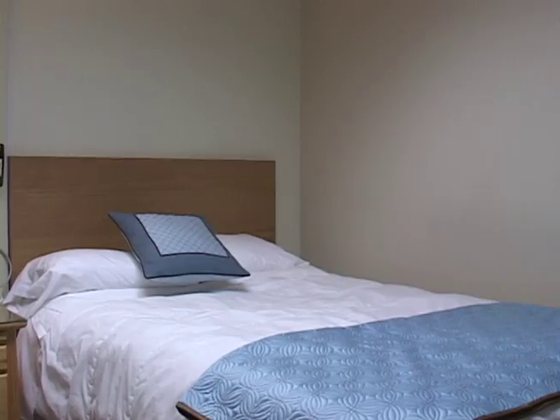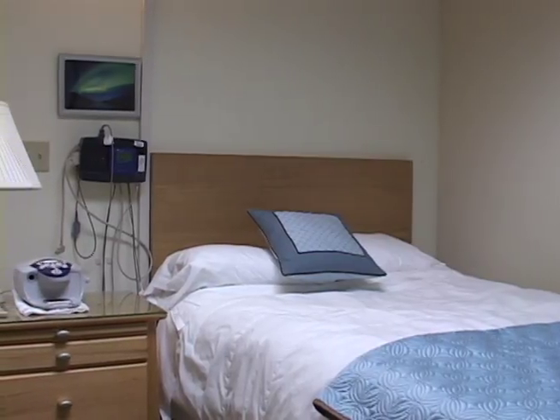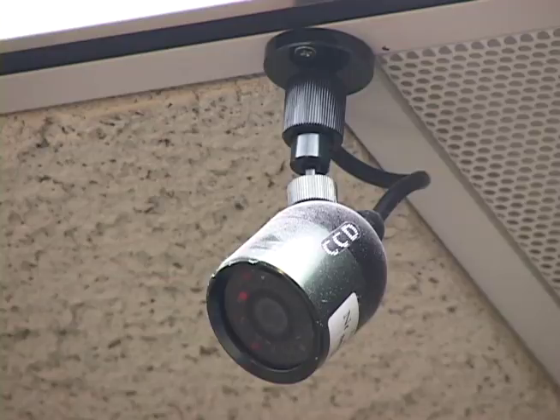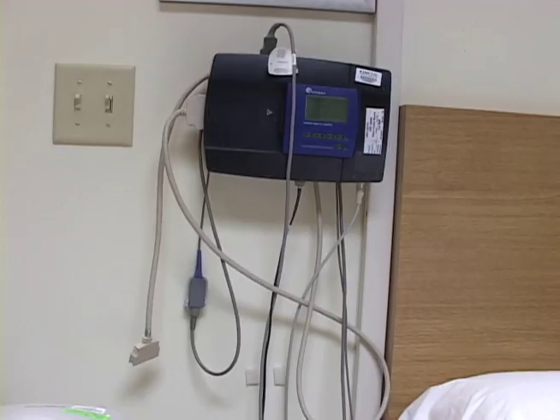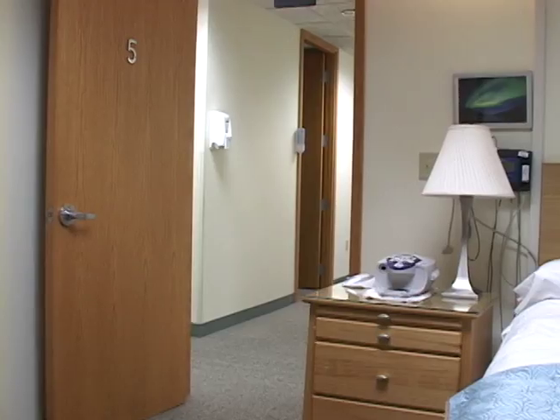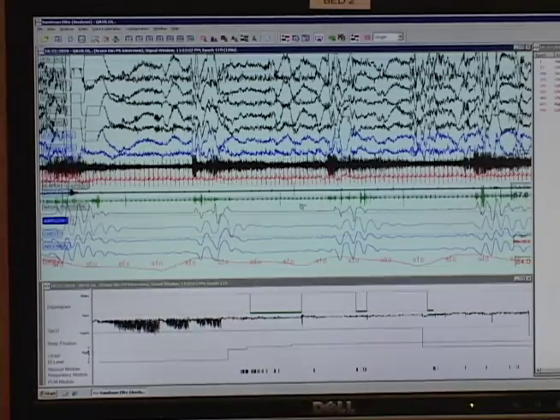And that's extremely important. To be diagnosed with sleep apnea, patients spend the night in one of these rooms where they are heavily monitored. A camera attached to the ceiling surveys their movement when they sleep. But they also attach to this hub, which records their blood oxygen saturation, breathing pressure through the mouth and nose, as well as their blood pressure and their leg movement. All of that recorded information is automatically charted by a computer.